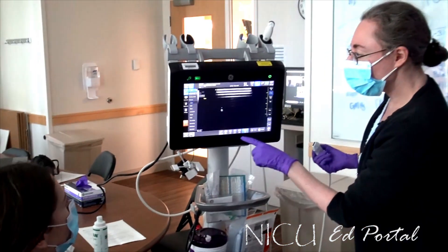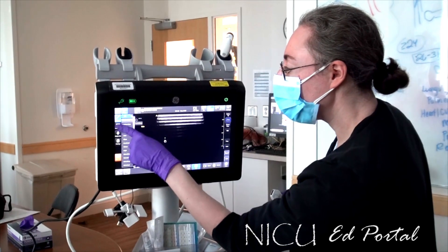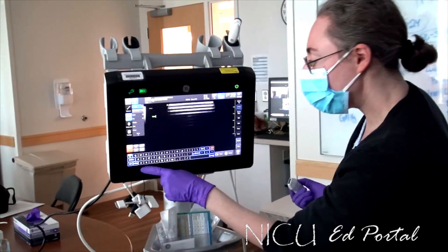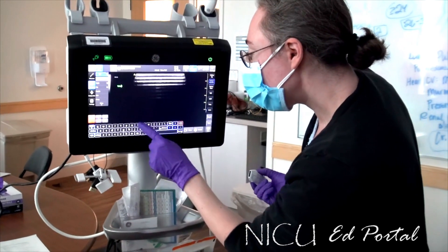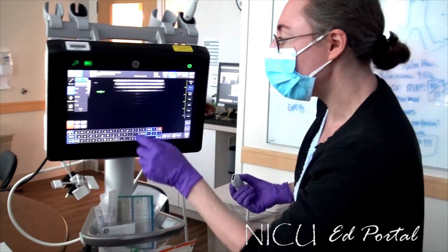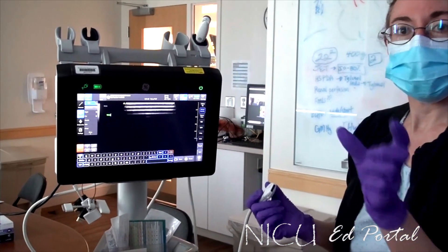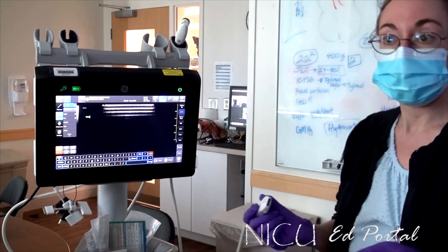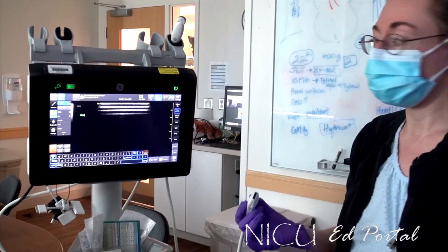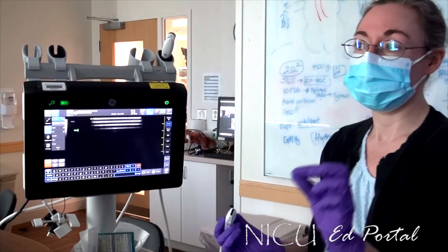Some people, what they do for ultrasound is they just put in a text that says 2IDV, which means two IDs verified. If you put 2IDV, that's an ultrasound way of saying you verified two IDs for the patient before you do the procedure. And then sometimes we even just put text right in the middle that says 'timeout' to document that we took the timeout before the procedure.